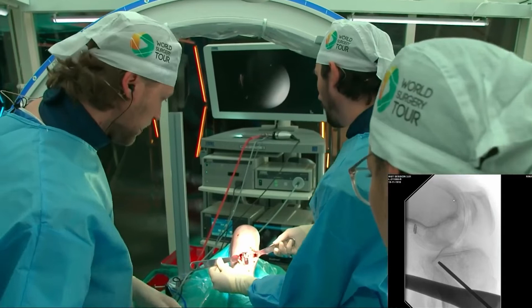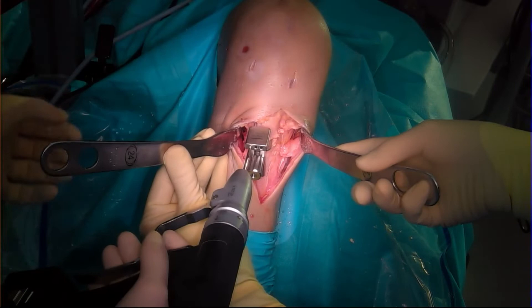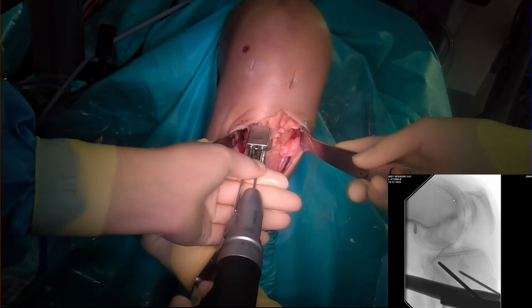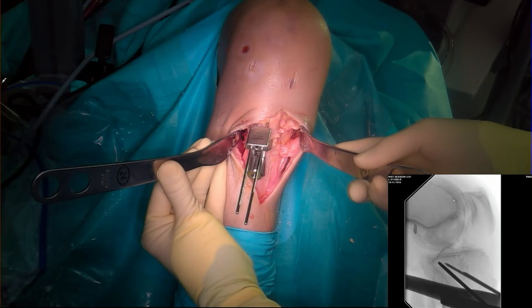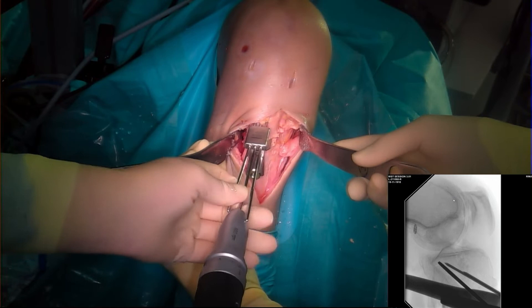The aiming device is from AAP — they brought the aiming device and the plate we use. We use a normal proximal tibial plate which can be used for HTO. We use one free screw to hold the closed osteotomy in the beginning, and then we can be totally relaxed and put on the plate. We have to place the plate a little more anterior so the screws don't fall into the hinge of the osteotomy.